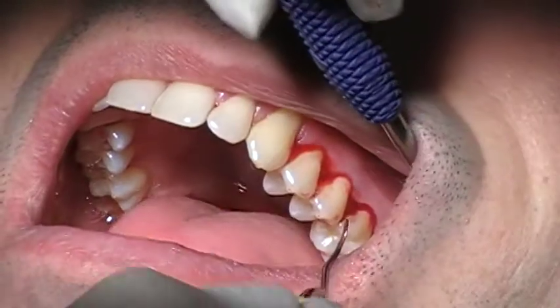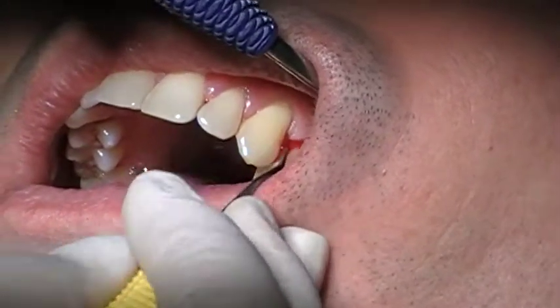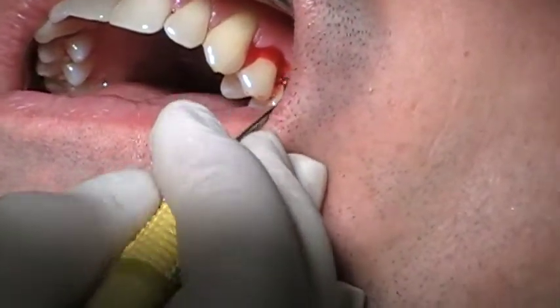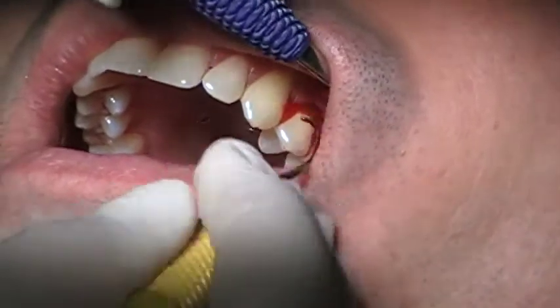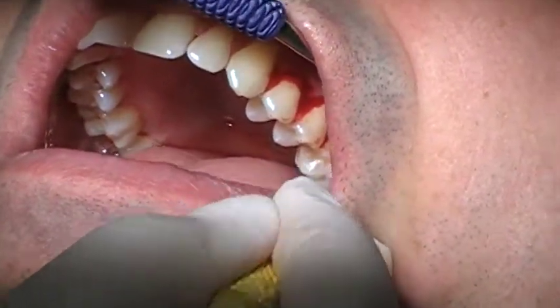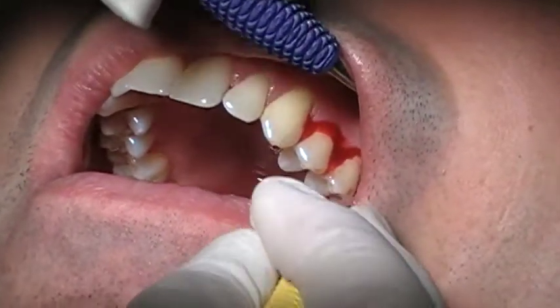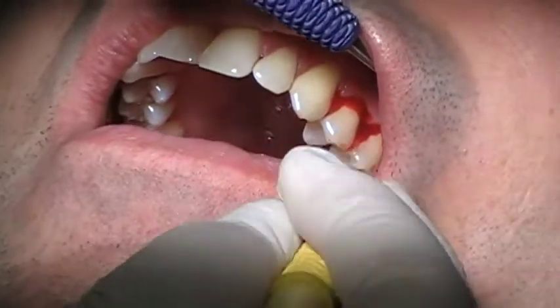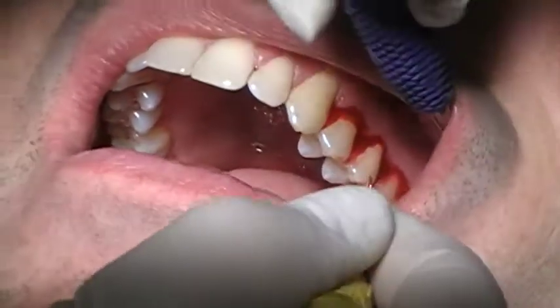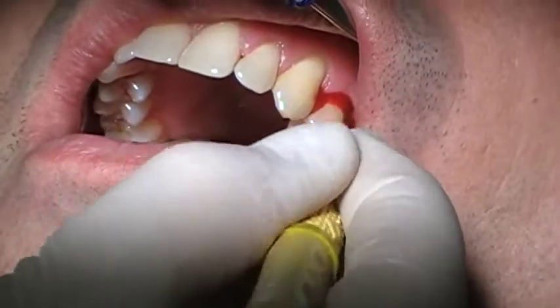You can see he's hemorrhaging. I'm going to go back and make sure I've got those smooth. I'm going to use it like a little explorer sometimes. Just keep that rolled and adapted to the mesial there as you come around that line angle, and get way interproximal, because if not, you'll miss that little spur of calculus, the little wing of calculus.